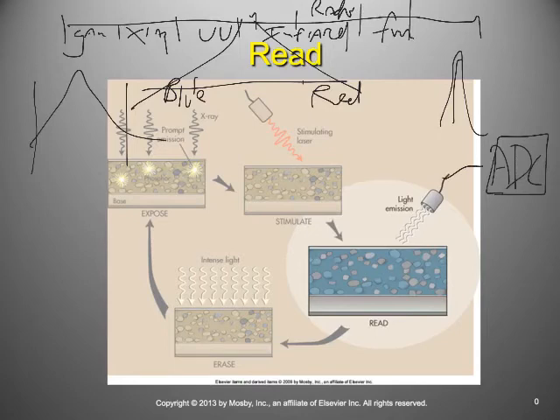So as this analog to digital converter works, it is going to be digitizing the image, and eventually, after it applies its histogram analysis, it produces the X-ray image. It does not have to go through all the weird filtered back projection stuff that a CT scanner does. It just renders it in relation to where it was at in the PSP. So it's a one-to-one relationship in terms of the geometry from the computer standpoint.